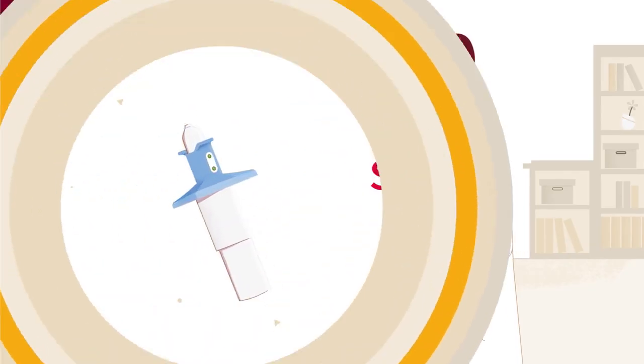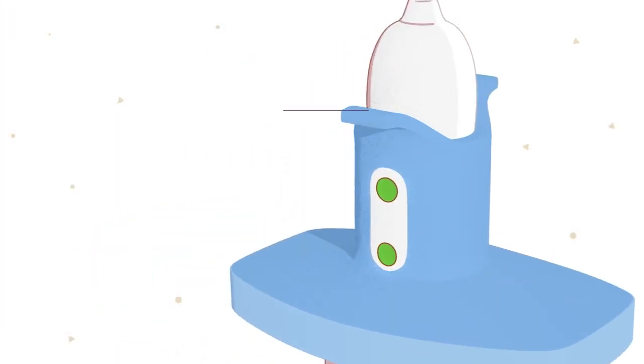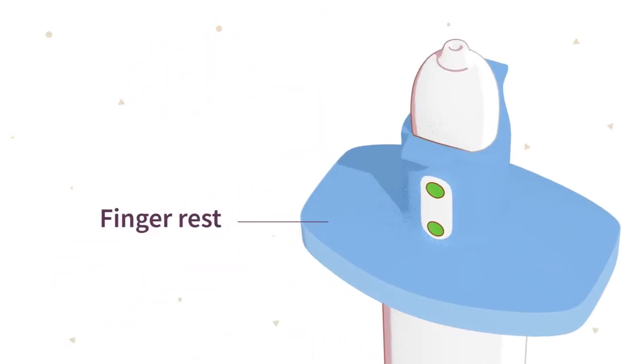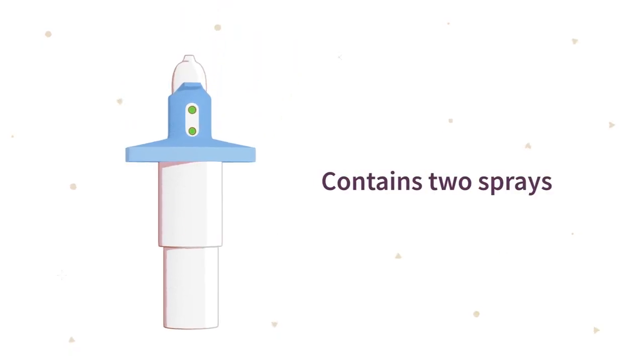Let's review the instructions for using Spravato now. Looking at the nasal spray, you'll see the top, nose rest, indicator, finger rest, and plunger. Each nasal spray contains 2 sprays inside, 1 spray for each nostril.